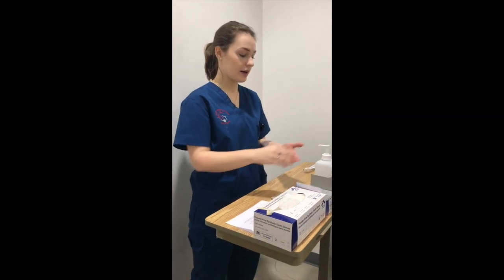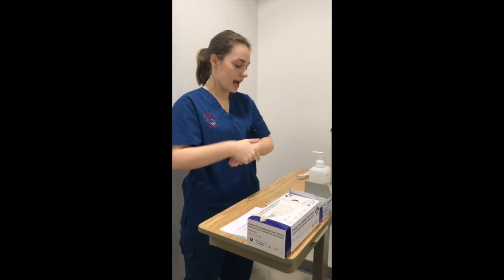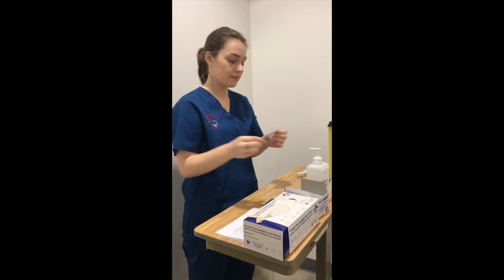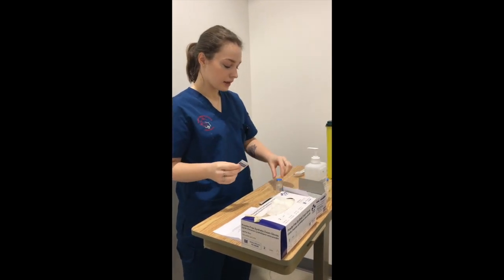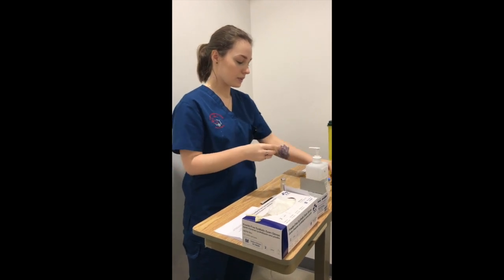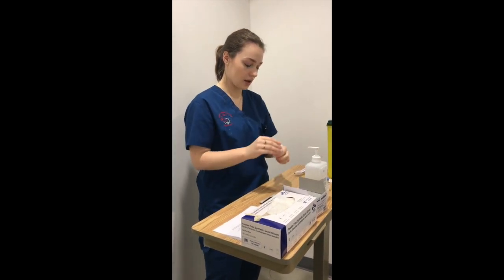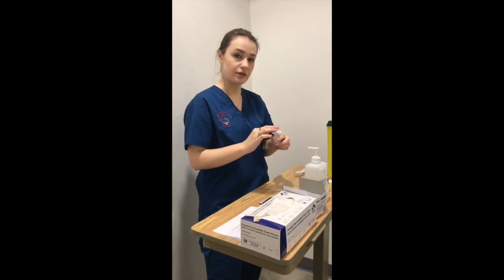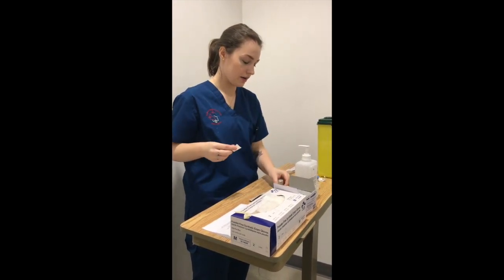And before we start preparing our injections, we're just going to do a little bit of hand hygiene. It's really important to do aseptic technique. So also when we go into Mr. Mancini's room, we're going to be putting on gloves just so that we lessen our risk of infection. So we're going to start and we're going to remove the little safety cap here. Then we're going to take an alcohol swab and we're going to begin to sanitize the top of the vial. This is again just to ensure that everything is sterile.